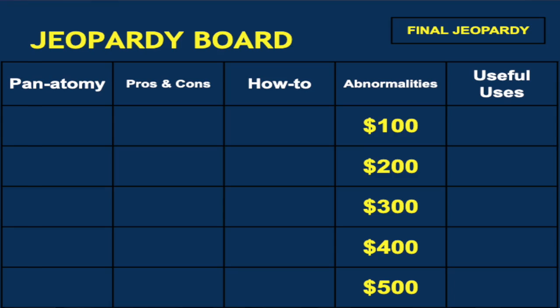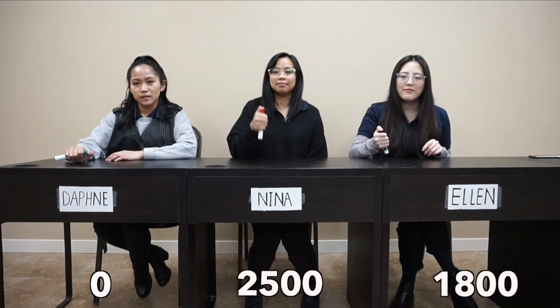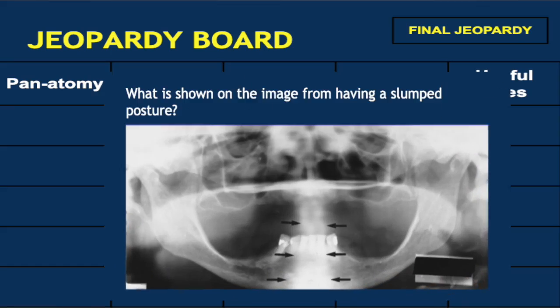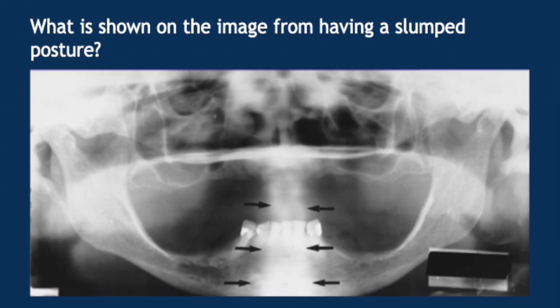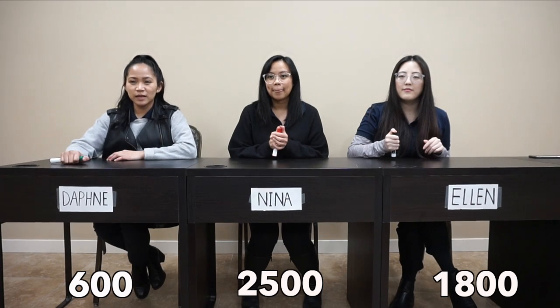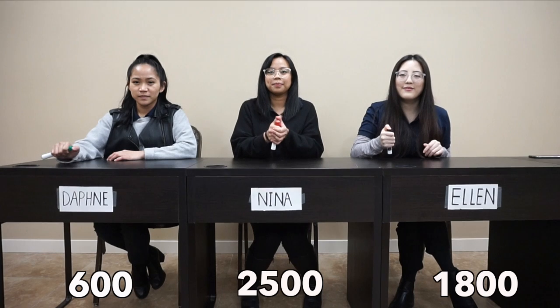Abnormalities for 100. What results in the ramus and posterior teeth being unequally magnified as seen on this image? Daphne. What is head turned? Correct. She's on the board, folks. Abnormalities for 500, please. What is shown on the image from having a slumped posture? Daphne. What is cervical spine? Correct. Abnormalities for 300, please. What results in a radiopaque cone-shaped structure on the image? Ellen. What is lead apron artifact? Correct.